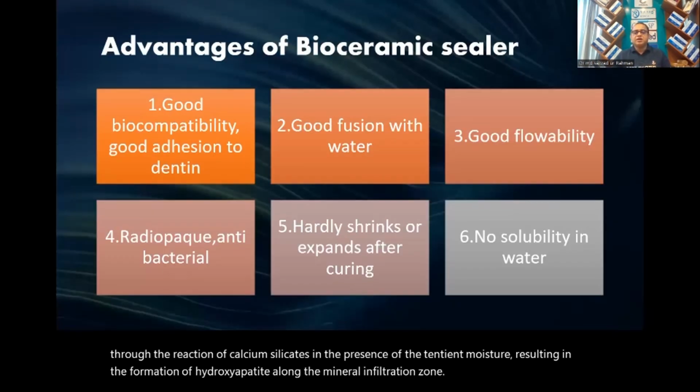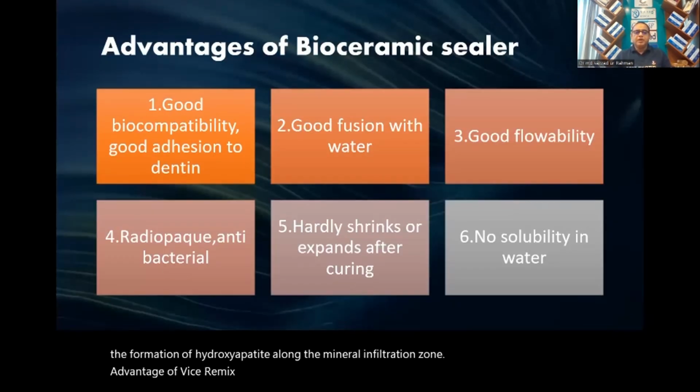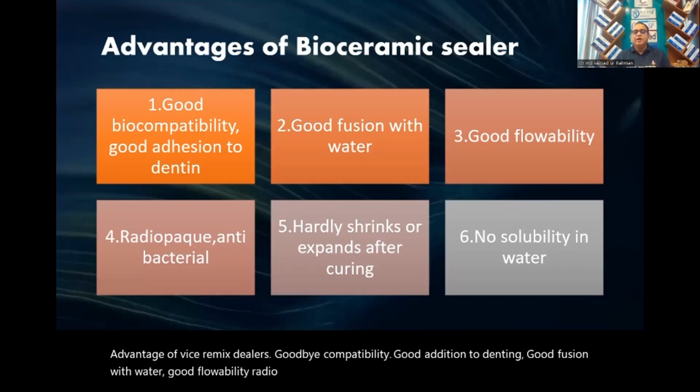Advantages of bioceramic sealers: good biocompatibility, good adhesion to dentine, good fusion with water, good flowability, radiopaque, antibacterial, hardly shrinks or expands after curing, no solubility in water.